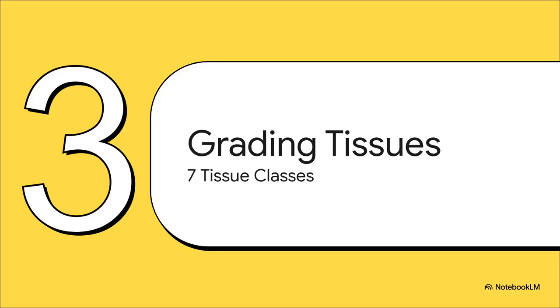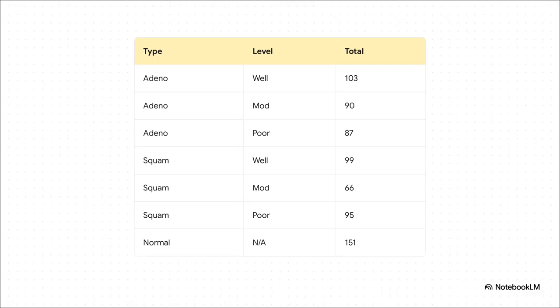Which brings us to section 3, grading and classifying tissues. Following some very strict medical guidelines, the tissues were broken down into 7 distinct classes based on their differentiation levels. So both adenocarcinoma and squamous cell carcinoma are split into well, moderate, and poor differentiation. You add in a baseline class of normal lung tissue, and boom, there are your 7 classes. As you can see, they are beautifully balanced across both magnification levels.